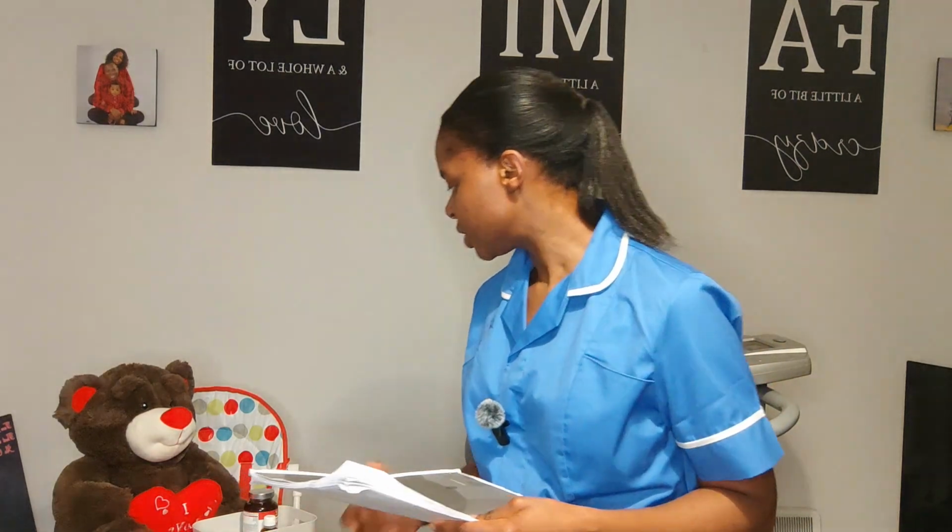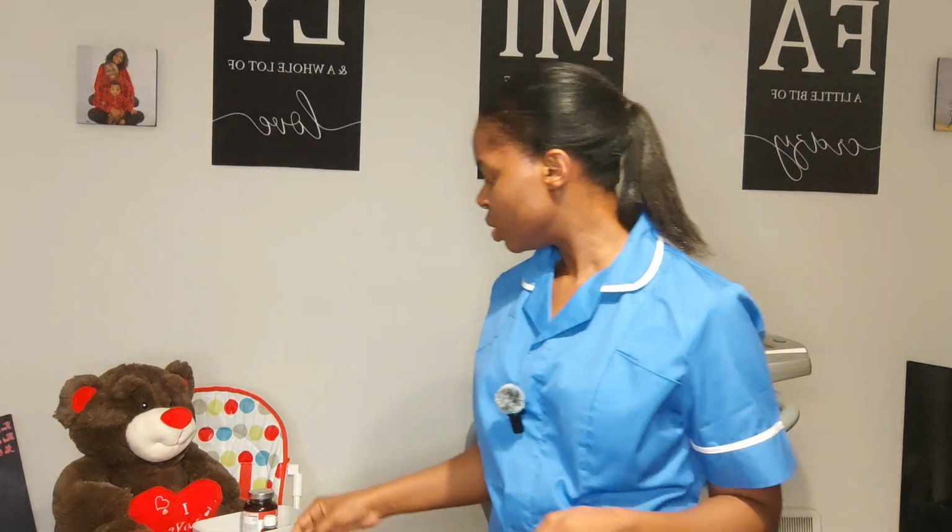And I'm happy to proceed. All right, so I'm happy to proceed with this. Also, I have a spacer device. It is clean and intact. Assessor, could you please confirm the spacer device is still in date? All right, thank you very much. I am happy to use it.